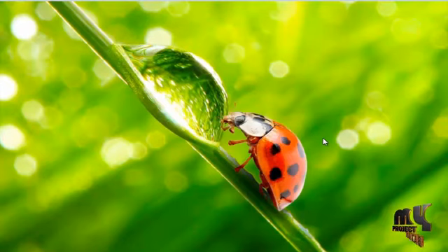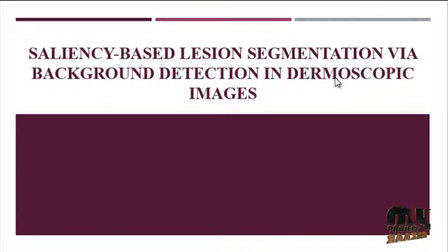Welcome to myprojectbazaar.com. Now we are going to discuss our product. Our product title is Saliency-based Lesion Segmentation via Background Detection in Dermoscopic Images.